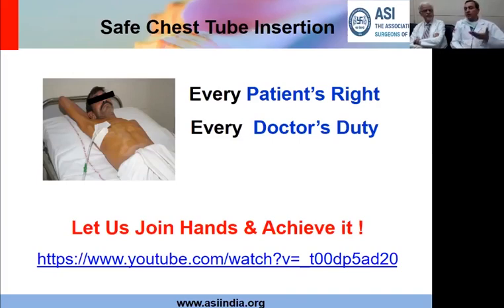If the patient is bleeding outside, then you have no choice but to shift the patient to theatre and have proper exposure. Usually, it may not be possible to do it under local; some kind of anesthesia support is needed, not saying intubation. You have to have proper light, proper asepsis, and all your instruments available, and then you enlarge the incision a little bit, see the bleeding site, and underrun it.